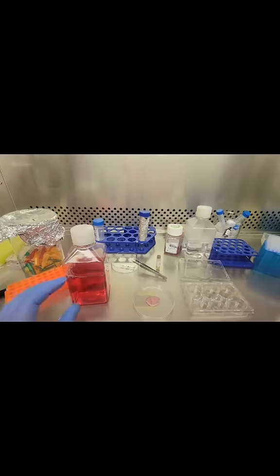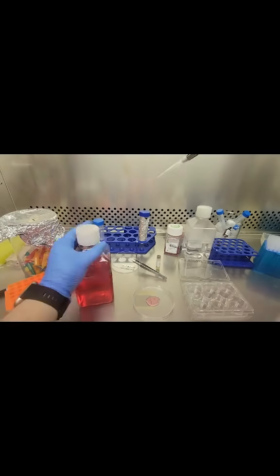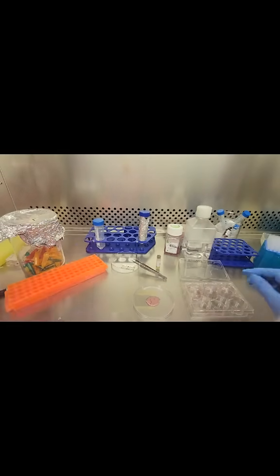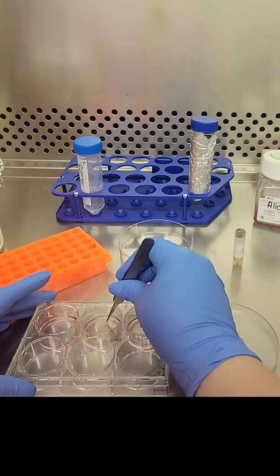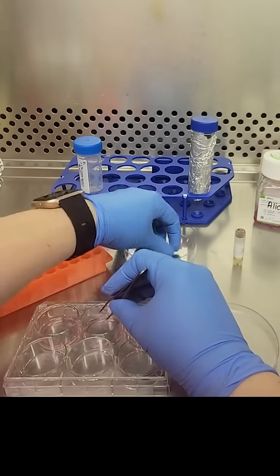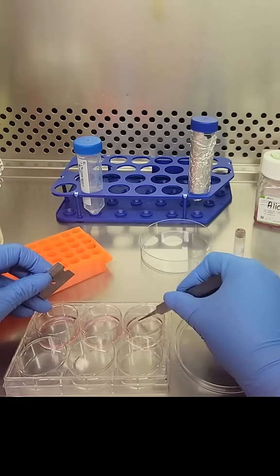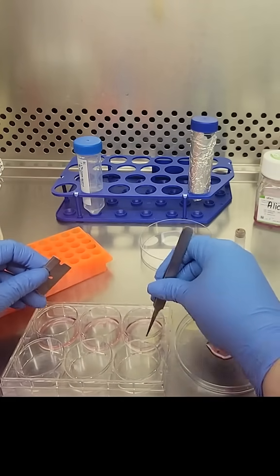I next coated the wells I was going to use with gelatin to help the cells stick to the wells, and now I'm going to add some fresh media into three out of the six wells — just enough to cover the bottom — and slowly place some of these pieces of skin biopsy into each of the wells.